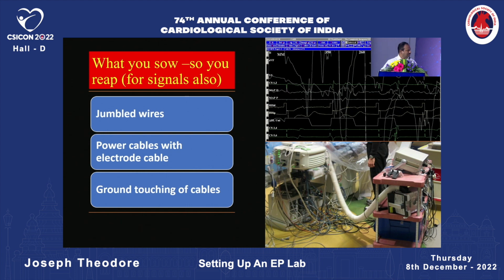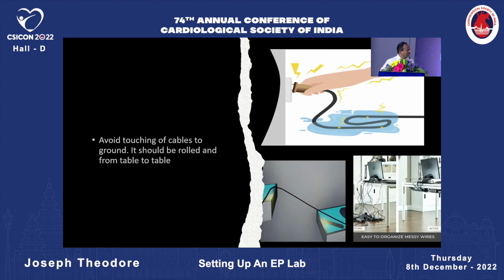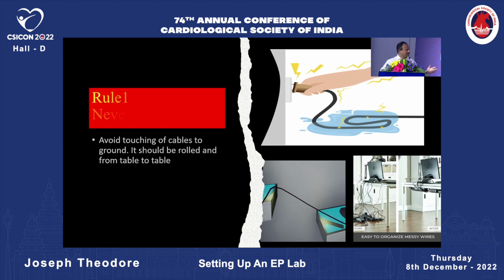Power cables with electrode cables should not be mixed up. If you're using the same extension box for connecting a power cable and your electrode cable, try to use a wooden box and keep them a little away from each other. Touching of cables to the ground should also be avoided. Next slide. This is most important, as it will cause much of the noise.